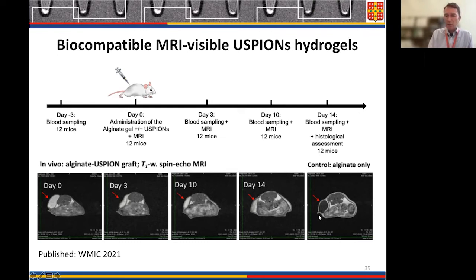And you see here the control is alginate only, so alginate without iron oxide nanoparticles, and you see that there's no signal inside of the hydrogel.